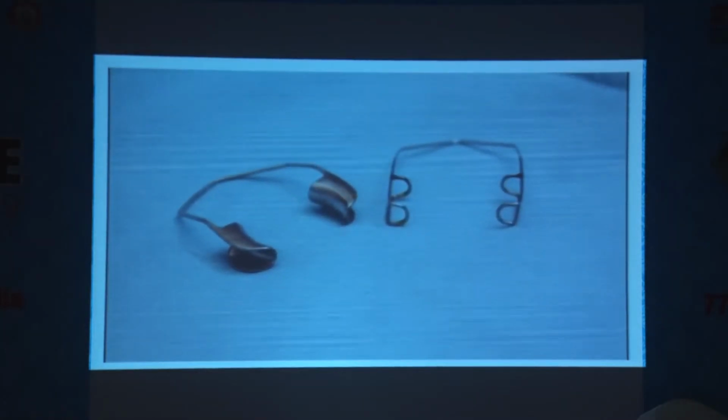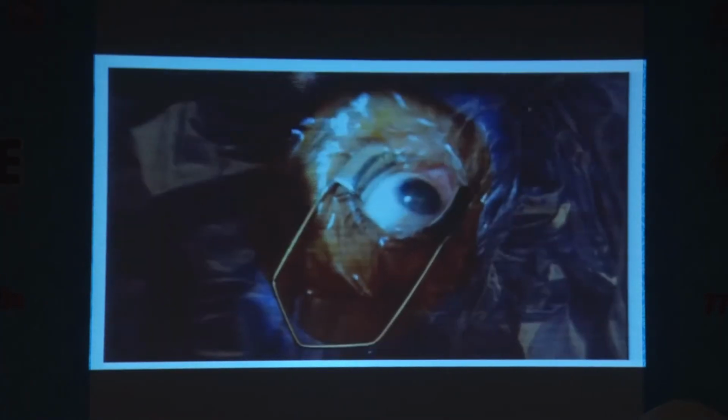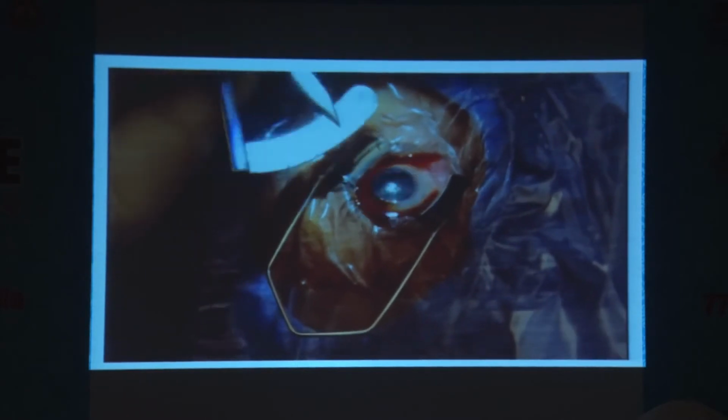There are two types of eyelid speculum, closed blade and open blade. A closed blade type helps to keep the eyelashes away from the globe, especially when a sterile plastic drape is not used. After placing the speculum, the drops are repeated. The patient is then asked to look away from the site of the injection.